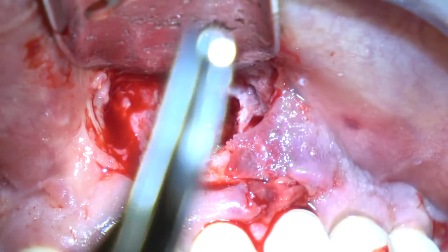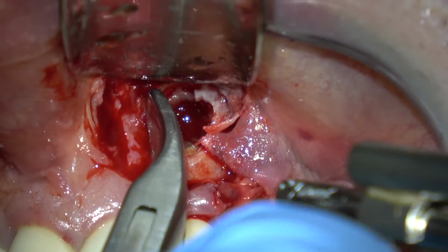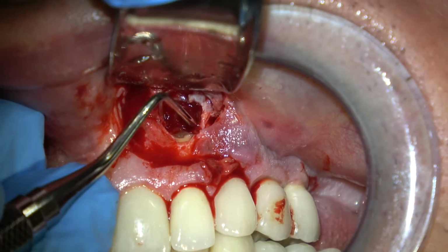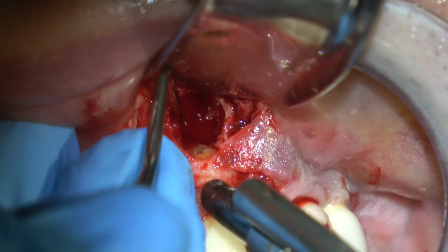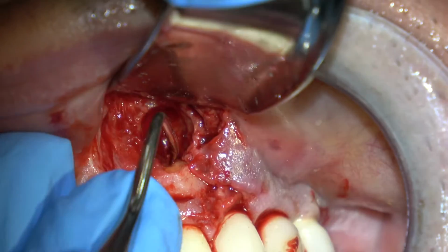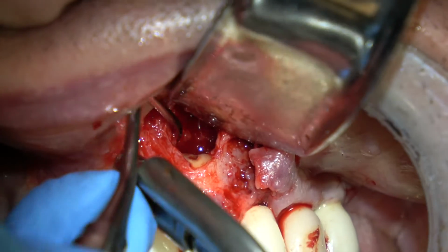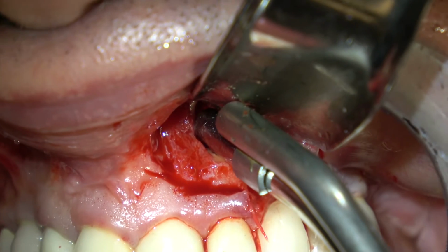My bevel is not as extreme as it was previously because I don't want to remove any more of the root on the facial or the bone on the facial. See, so now I've got access to all the granulation tissue with my spoon. For a procedure like this, I normally schedule about an hour. So now I've removed most of the granulation tissue and I'm down to alveolar crest.